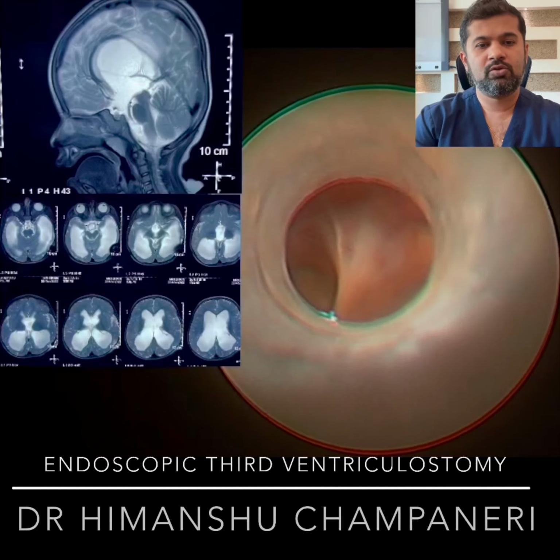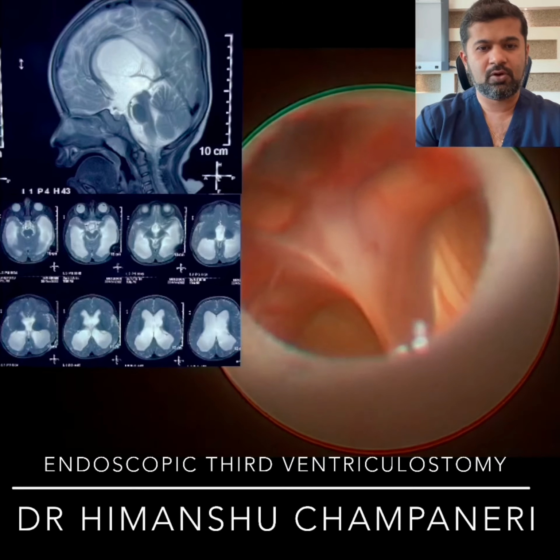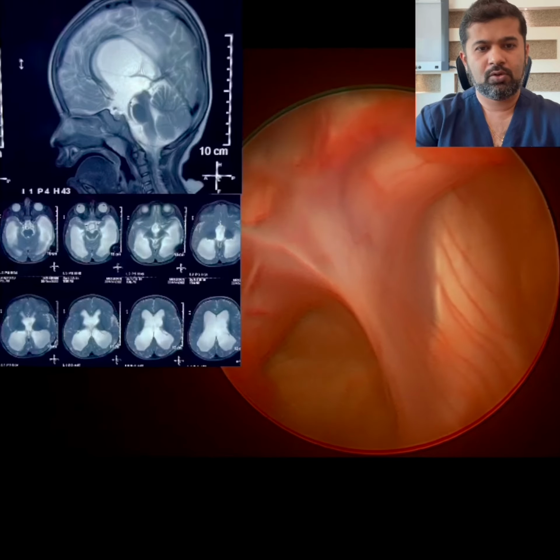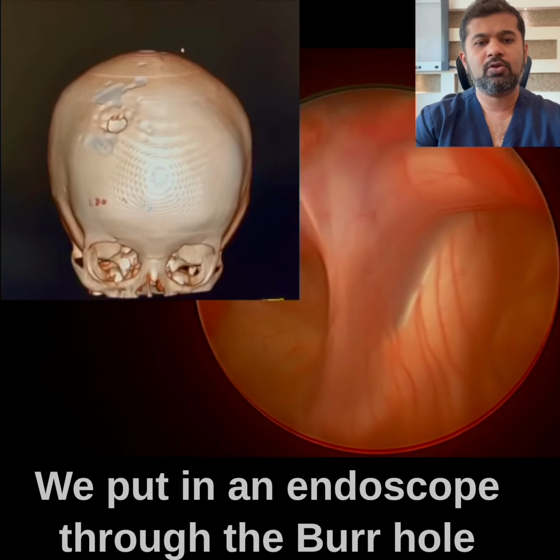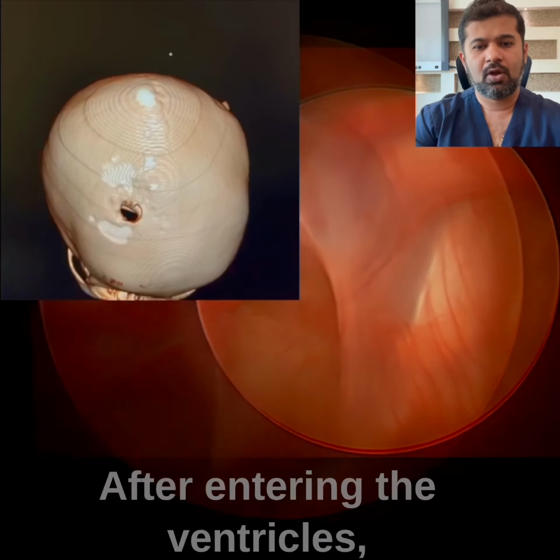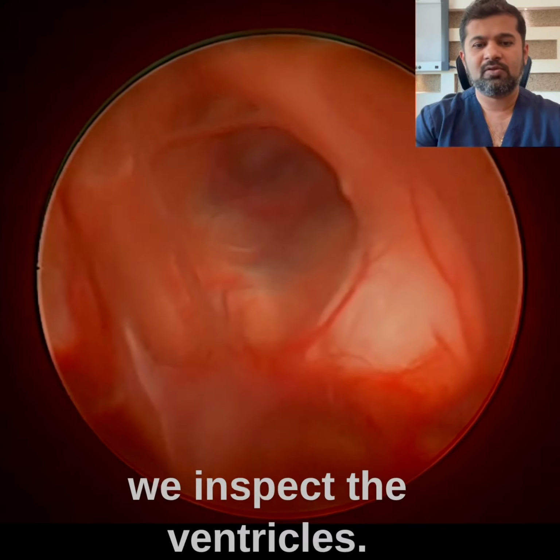This is a 2-year-old child diagnosed with aqueductal stenosis. You can see the dilated third and lateral ventricles. We put in an endoscope through the burr hole in the right frontal region at the Kocher's point. After entering the ventricles, we inspect the ventricles.